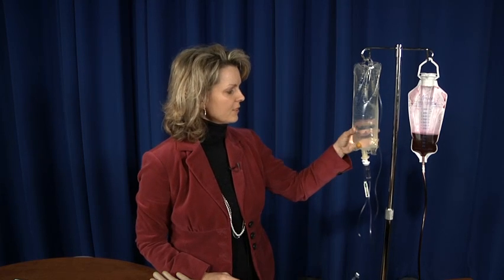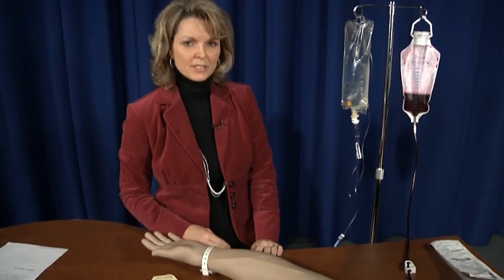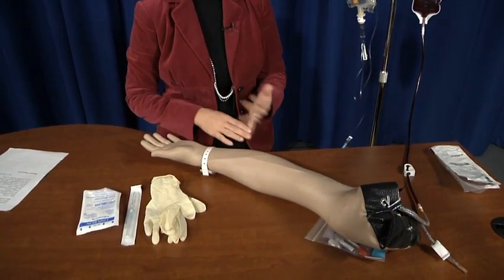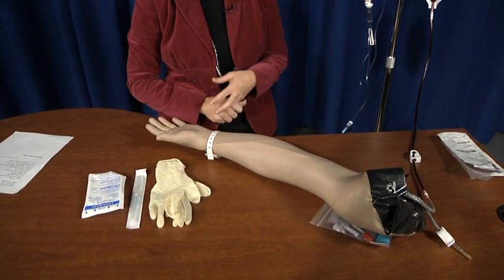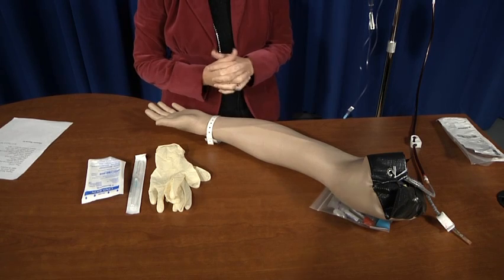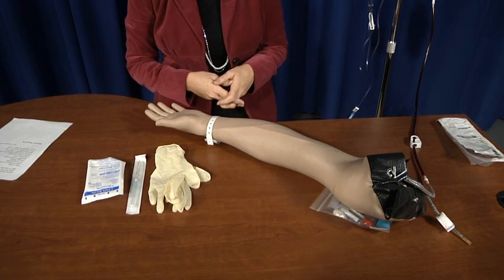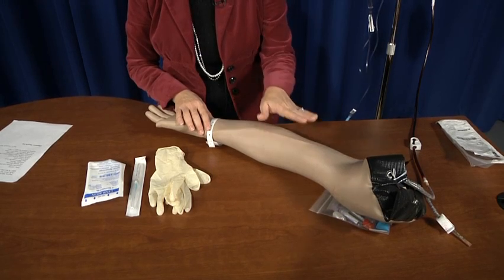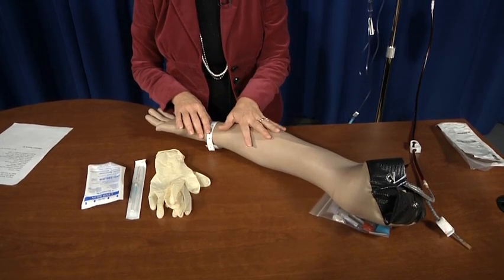Okay, now that we have our solution set up with our administration set, it's time for us to access a vein. The first thing we're going to want to do is go in and talk to our patient. We need to identify the patient. We need to tell the patient what we're going to do, and then we need to answer any questions that they may have to make them feel more comfortable. The next thing we'll do is assess their arm for a good site.